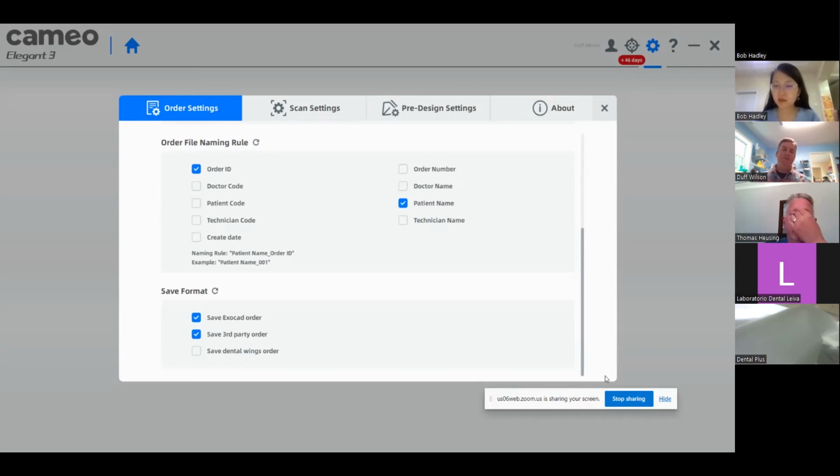So if you added $10 a unit to that office, I'll get you the scanner, but I have to add $15, $10, whatever makes the number right, and you'll be able to go digital. On the back end, I don't have to have all this model work.